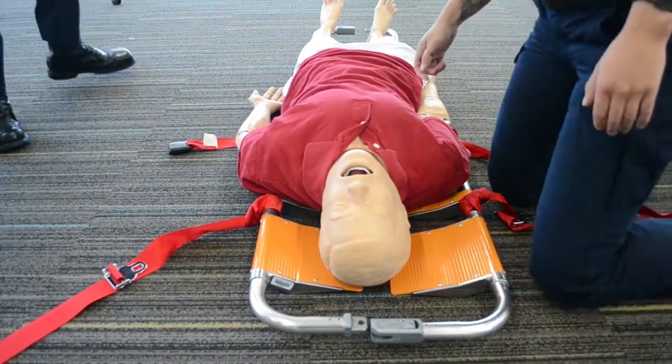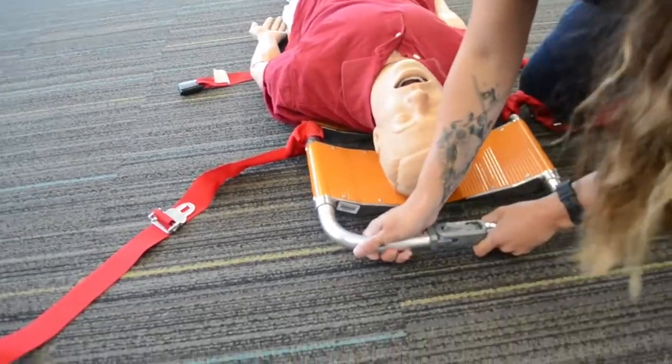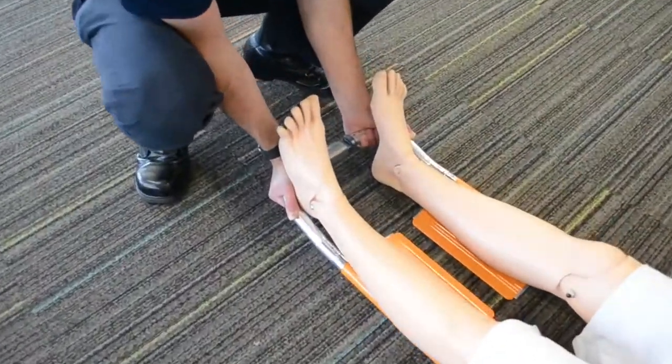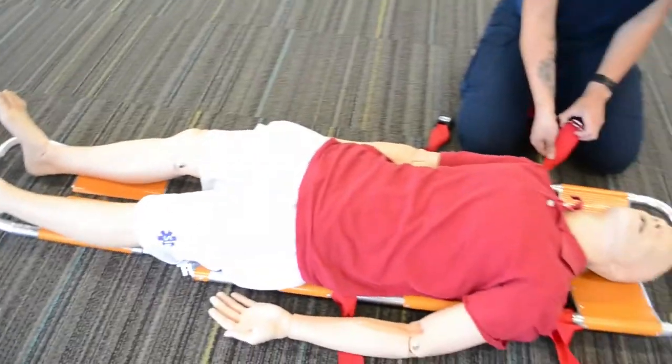We're gonna clip in one side first — we're gonna start at the head. There, just clipped in. And now at the feet. Now we're gonna strap our patient in.